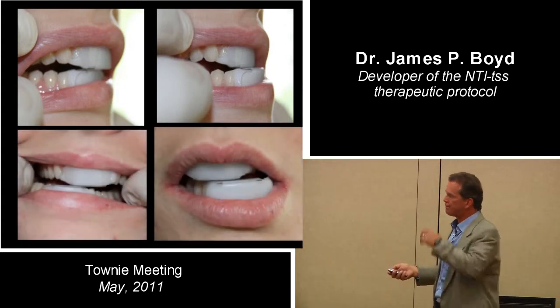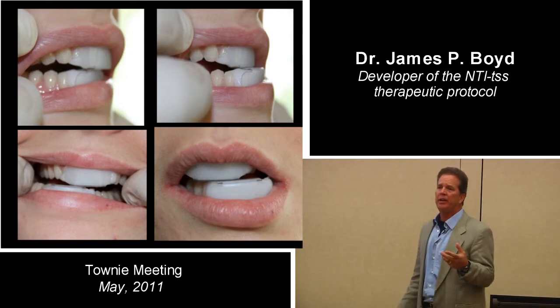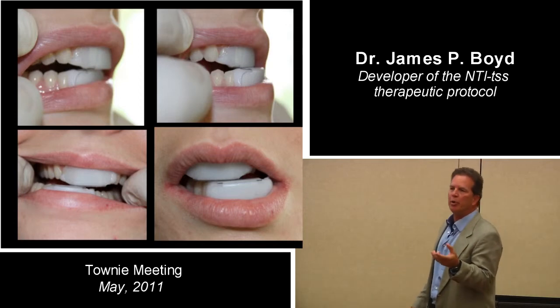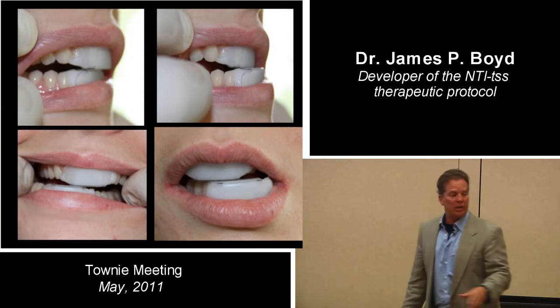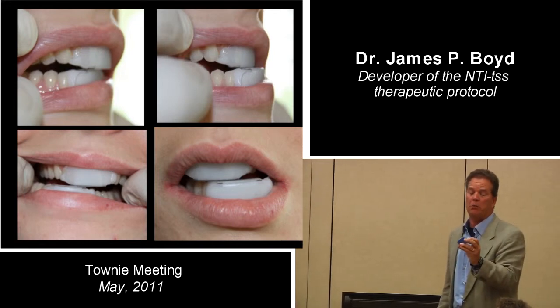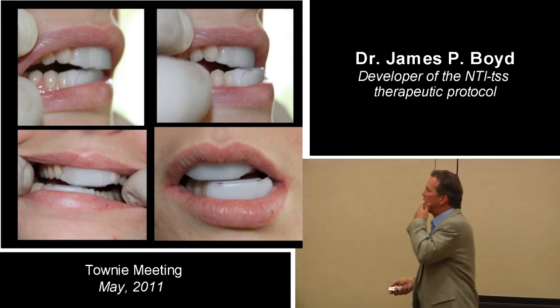Here's excursive. Some people don't want that, though. They don't want two big marshmallows on their teeth. And this is something that I can do real quick and easily. And I can call them, these are provisionally permanent. And if you really like that, you want that one's clear and colorless, and I go, you want one that looks sort of like this, and you'll have to wear one on one arch. They go, yeah, that looks great. Or they go, whatever. But it gives me the ability to do something quickly.